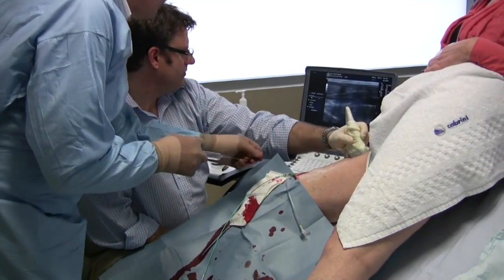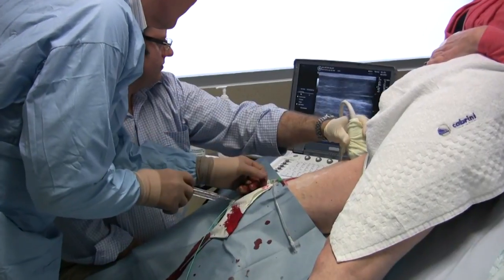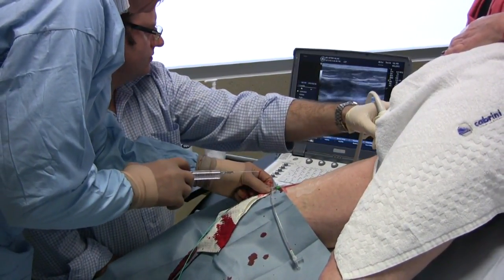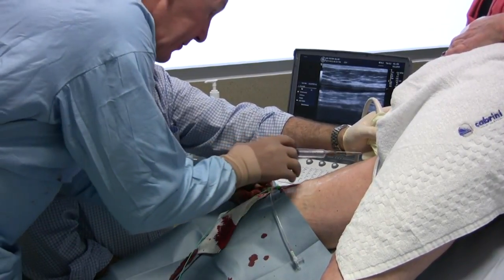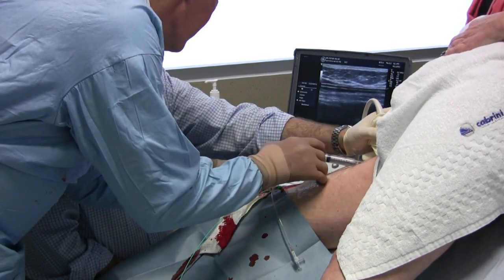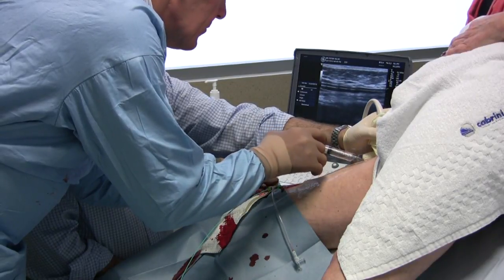Local anaesthetic is now introduced along the course of the vein, using ultrasound to guide the introduction of same for accurate localization around the vein to be treated. This means that when the laser applies heat to the vein, it produces no discomfort for the patient.